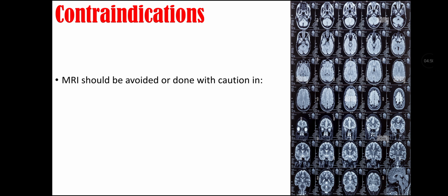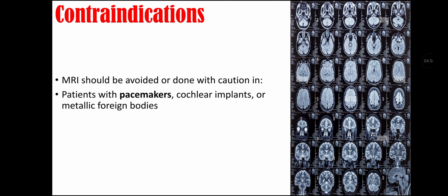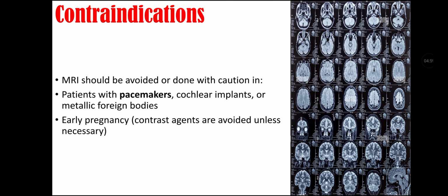Contraindications of MRI. MRI should be avoided or done with caution in patients with pacemakers, cochlear implants, or metallic foreign bodies. In early pregnancy, contrast agents are avoided unless necessary. Also in patients who are unable to lie still.